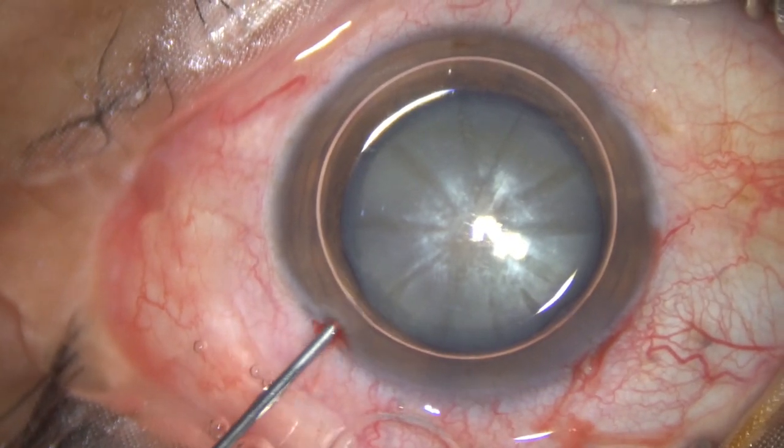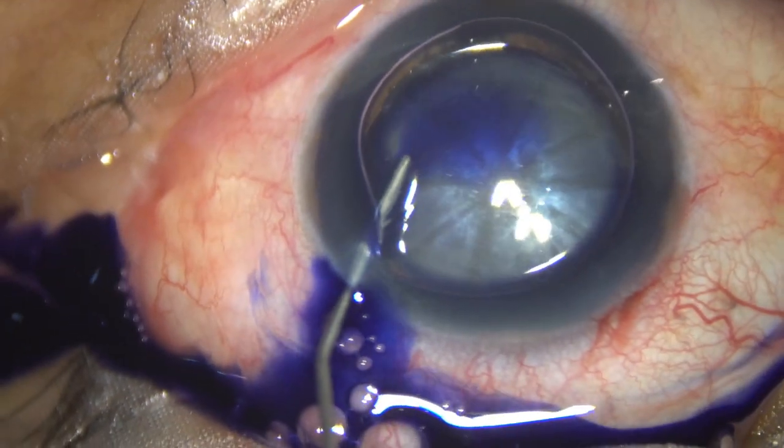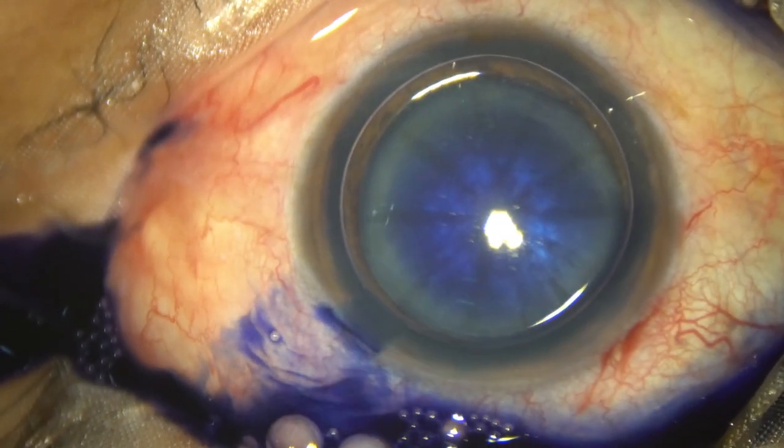An air bubble has been injected. Underneath this air bubble, this is trypan blue dye staining the anterior capsule of this intumescent cataract.